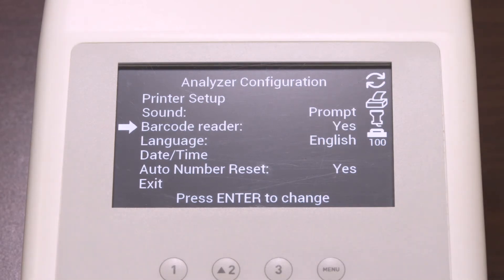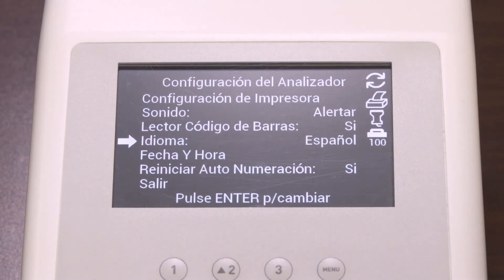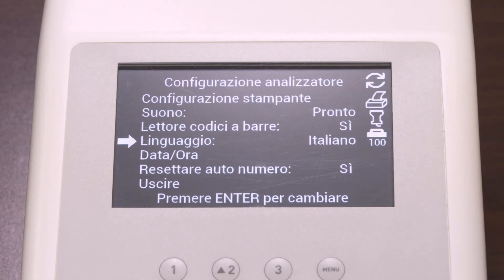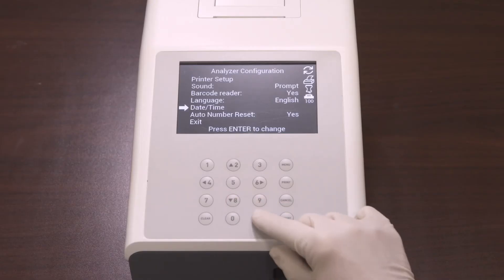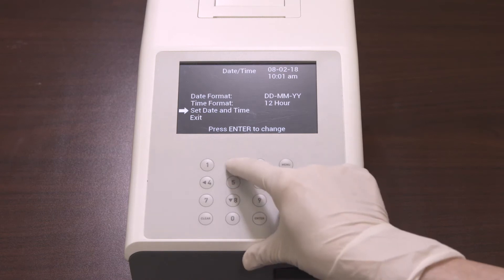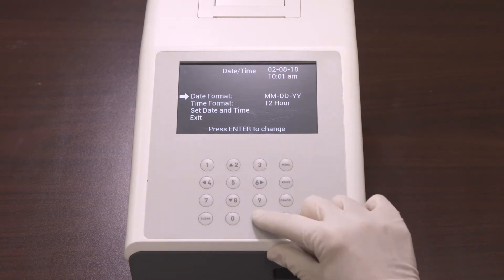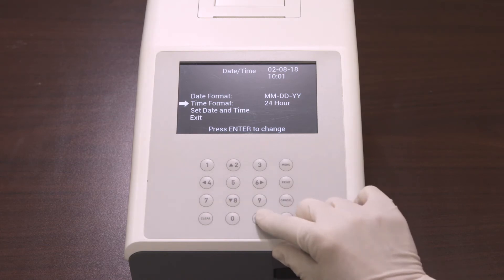The next selection is the language. Select the language and press Enter to change the current language — each time Enter is pressed, the language changes. Then set the current date and time by selecting Date Time and pressing Enter. This will allow you to set the date format, time format, and set date and time.